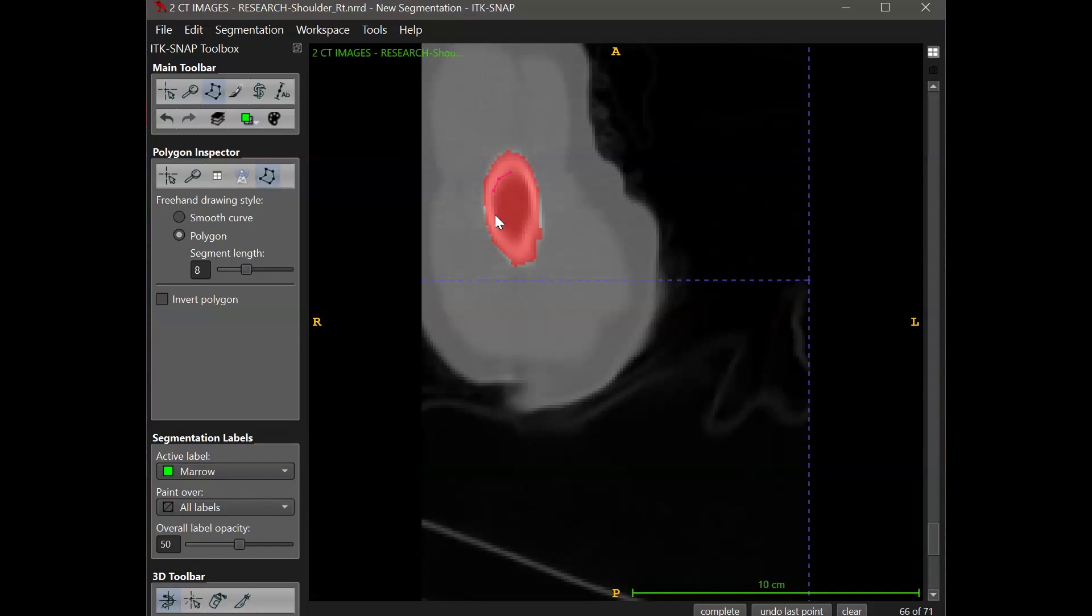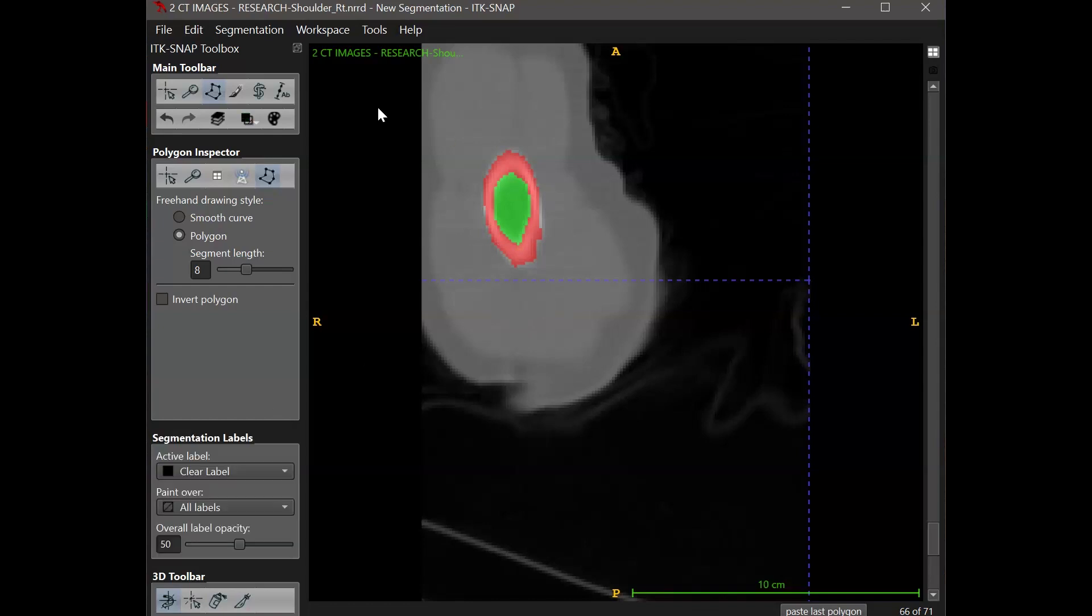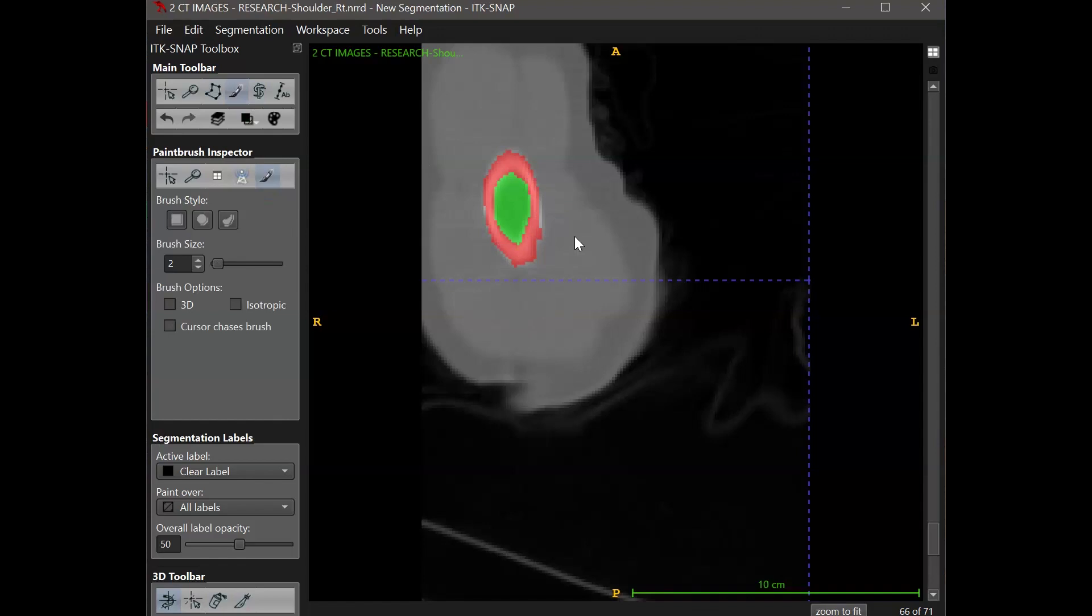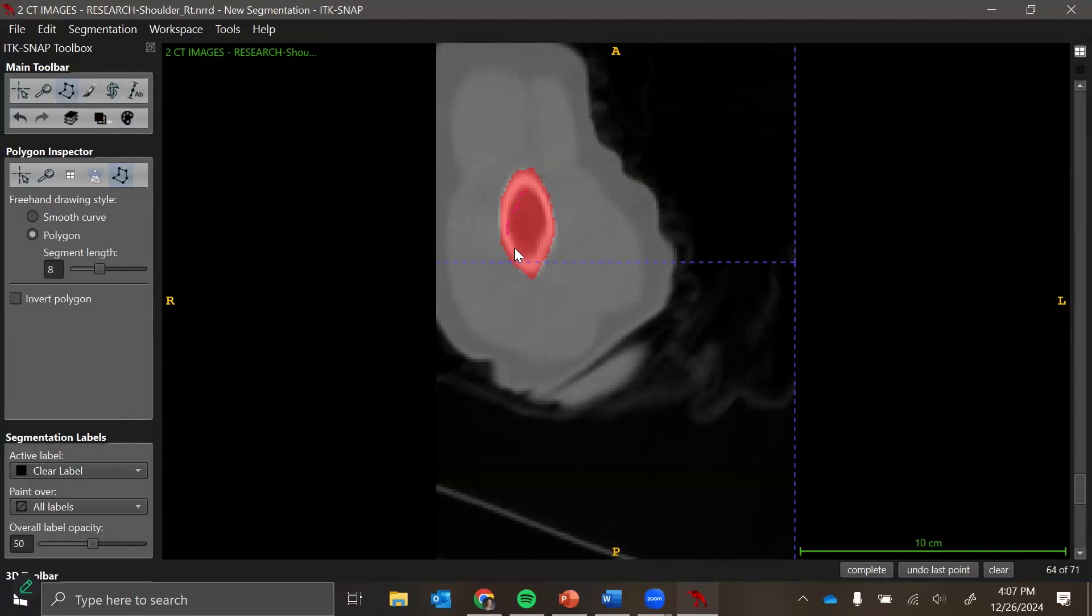But I might want to actually disregard that middle section. So a couple different ways I could do this. Since I don't want that intramedullary cavity in the segmentation, I can either create a new segment with this if I want to keep it for something else, making sure that paint over all labels is selected. Or alternatively, I can just paint over that medullary cavity area with the clear label to erase it.